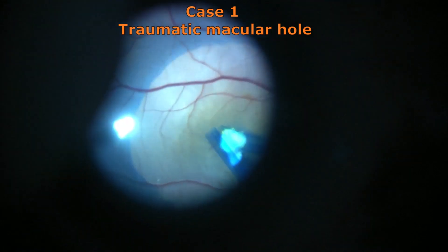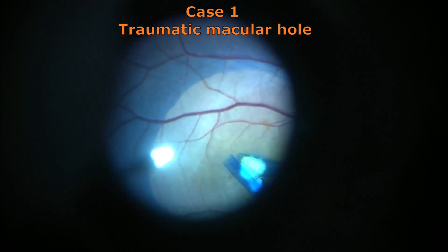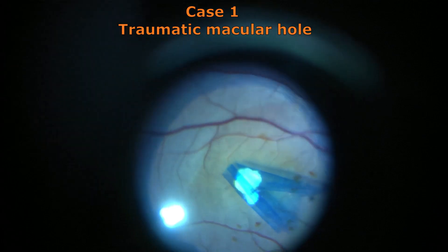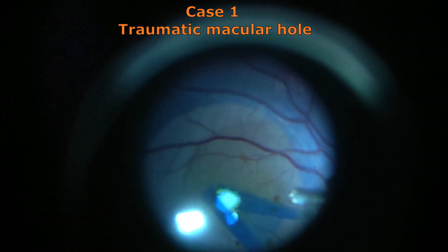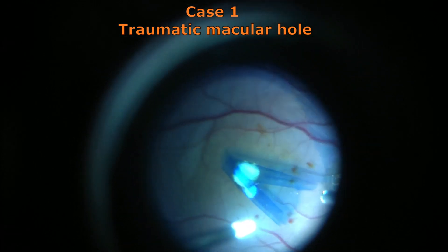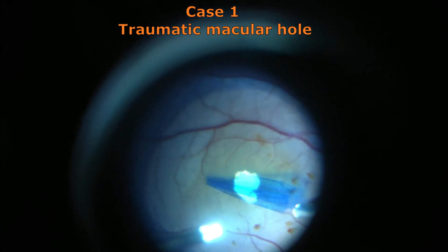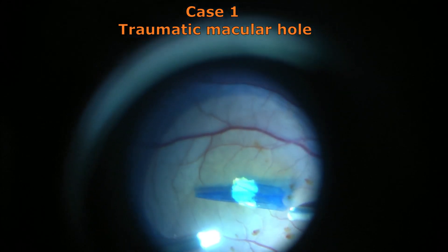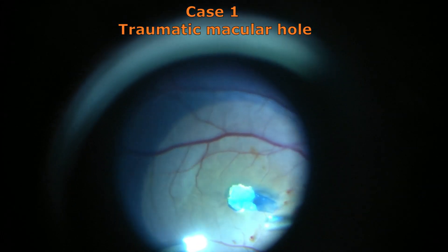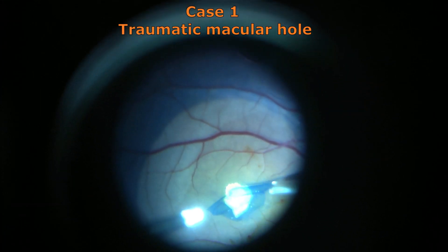Here I have left behind the flap which is attached to the edges of the macular hole, because it is a traumatic macular hole and a large hole, so we need some kind of scaffold which can be the ILM itself adhered to the edges. Now we will trim this ILM using a high cut rate and a low aspiration flow rate so that the edges attached at the macular hole will themselves provide a scaffold for the retina to come back and the borders to join.